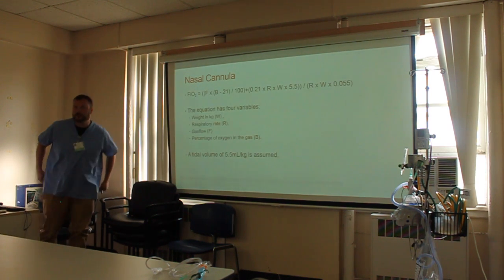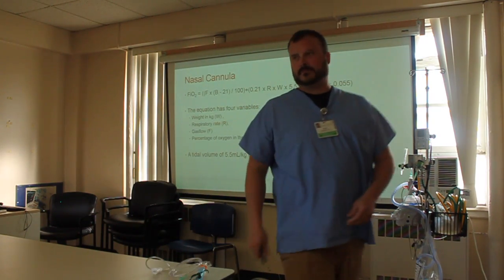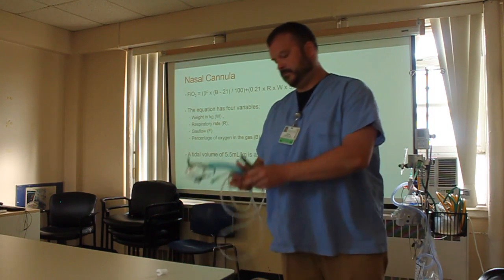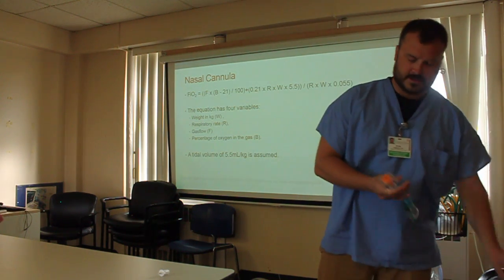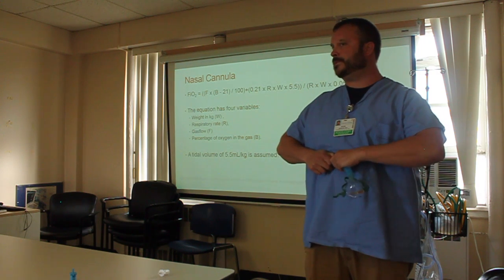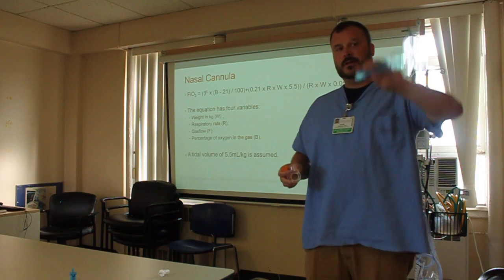So this is what the oxygen tube. That mask. We just hold up the mask. Do you want to see where that orange piece comes on, how it connects into it as well? And then the oxygen tubing goes in here. It's like a puzzle. And I get this call all the time where we're like, something's out, right? And I go out there and just one piece of the puzzle is out.